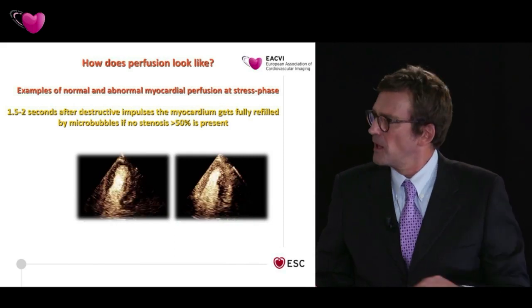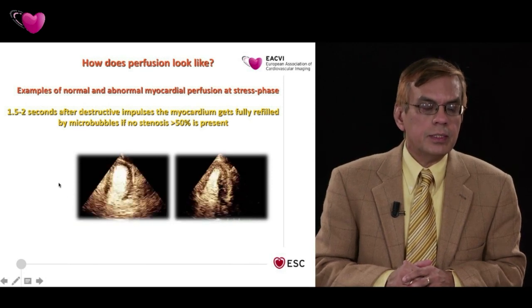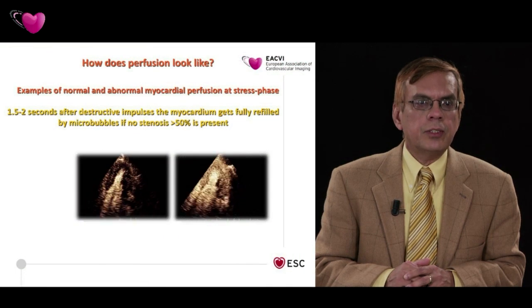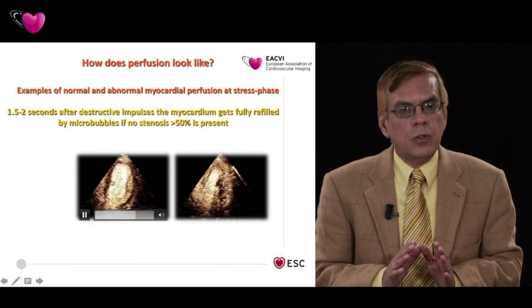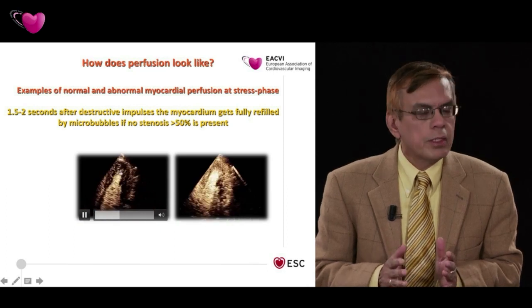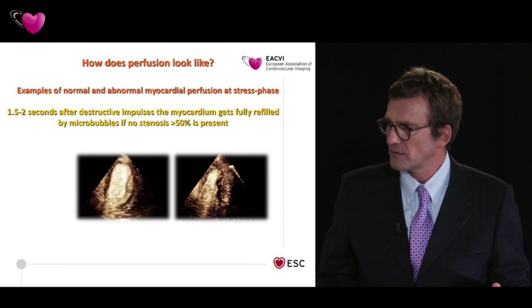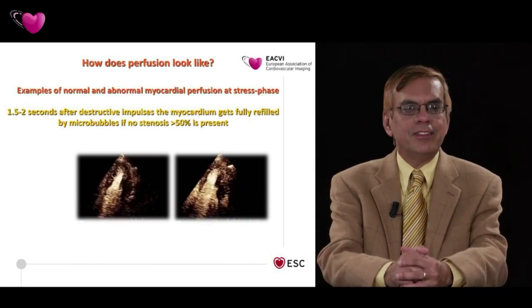And also, Nicola, what we are showing here is very relevant, because it's a very nice demonstration of wall thickening. Sure. If you go back to that, let's play it. You can see a very nice demonstration of wall thickening. Yes. And all you are doing is a flash replenishment for perfusion. That's it. The setting is the same as you use in stress echo for wall thickening. Absolutely. So you're not doing anything extra to look at perfusion. No, there is in fact no reason. So it's a bonus. Yes, it's a free bonus while you're using contrast.